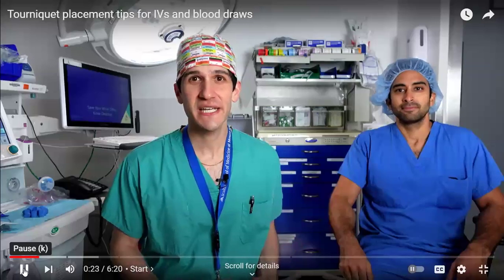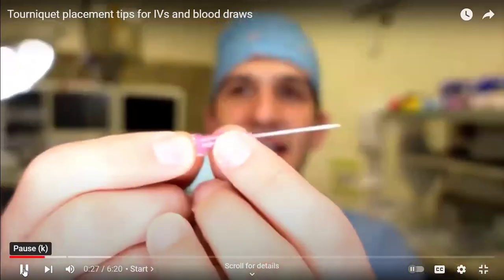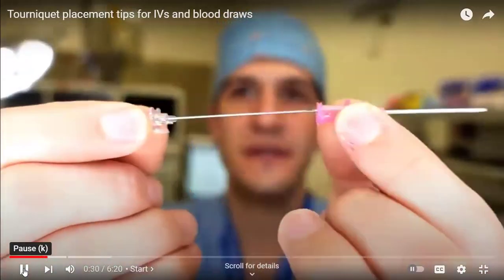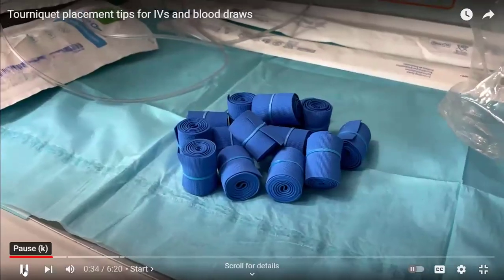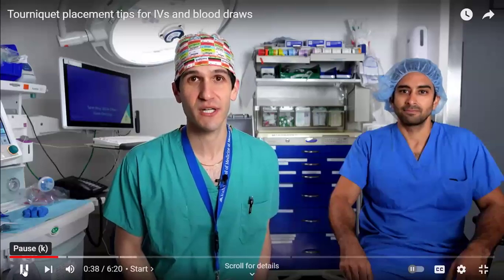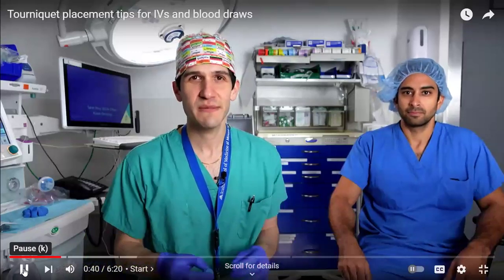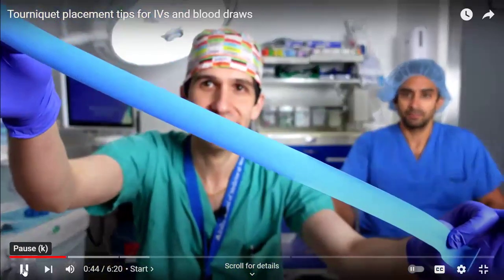Placing a tourniquet can be used either for doing blood draws or, more commonly for me, placing an IV catheter. The only thing you need for the tourniquet placement itself is a pair of gloves and, of course, your tourniquet. If you will be placing an IV or doing a blood draw, then you'll need all relevant equipment for that. Tourniquets come in many shapes and sizes. This is what a standard rubber tourniquet looks like.